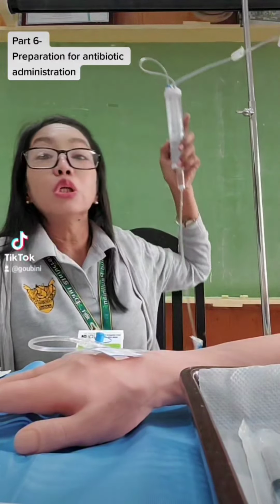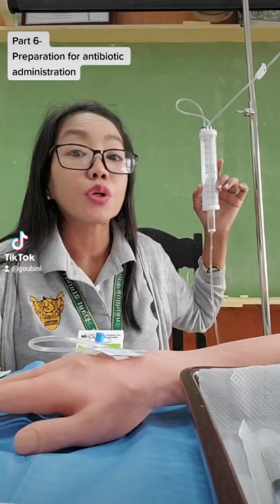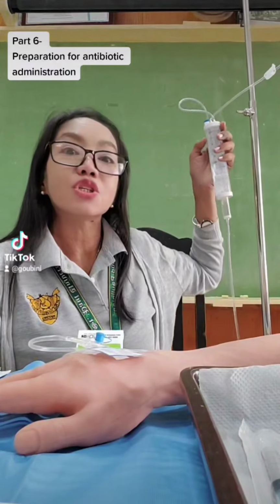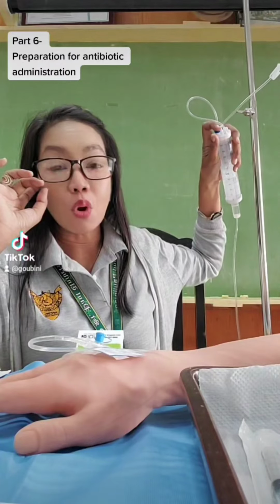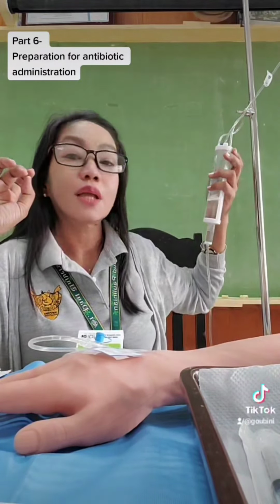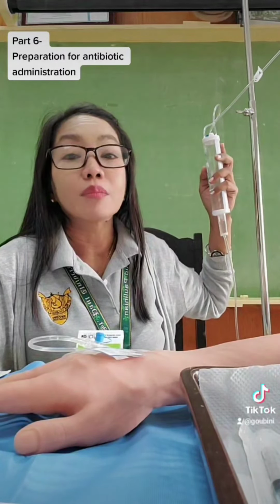Apart from that, you need a soluset. This is where we will dilute your reconstituted medication from the vial. So we will inject it later in this port, this part of the port of your soluset, reconstituted in 50 cc NSS.